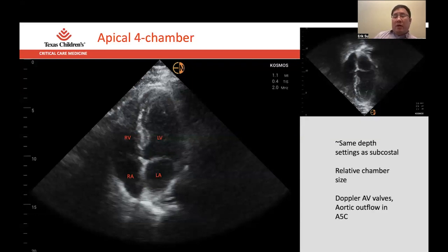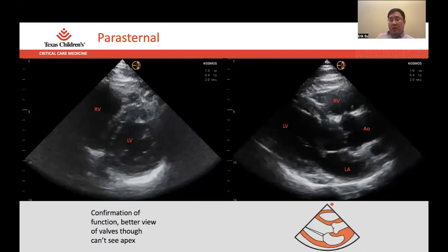All these things, you're already starting to get a sense for what's going on with the heart. You've seen all four chambers and the relative size. And then with the peristernals, I'll be fair to you, a lot of echo labs start in peristernal, but a lot also start in subcostals. The benefit of using the peristernals at the front end is just that you get a very crisp image of your valves and your chambers. But to get that big picture, the other views sometimes are a little bit more useful, particularly for effusion. So it can be up to you. There's no rules about this specifically, but just what we recommend to folks that are training here.